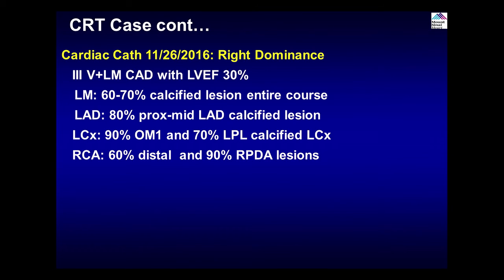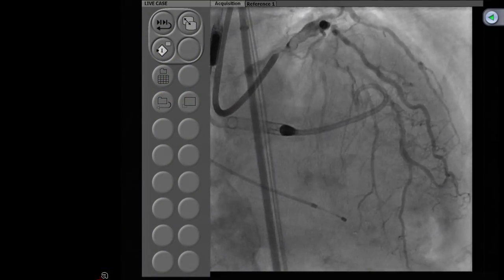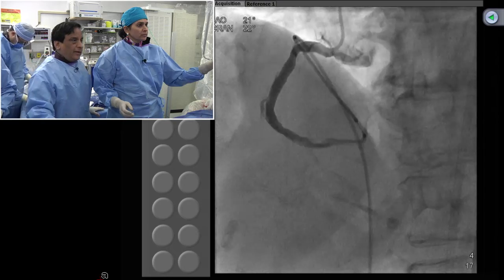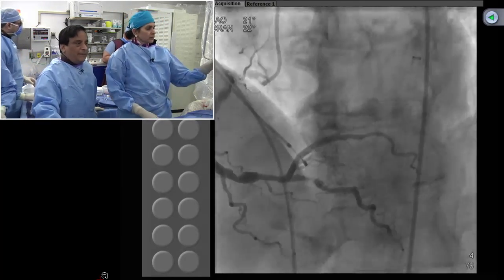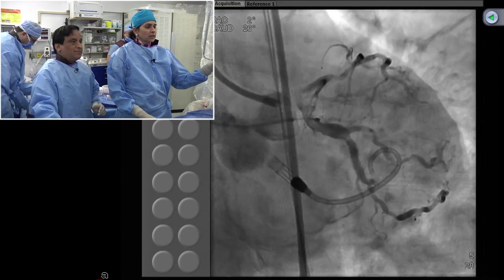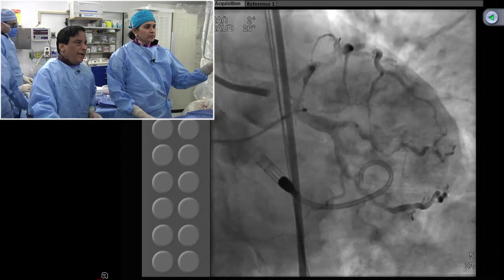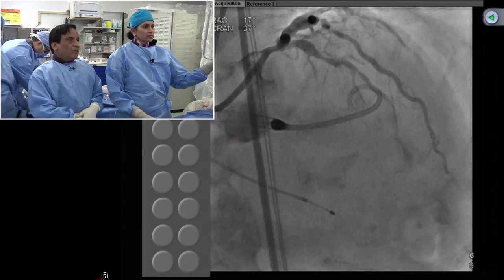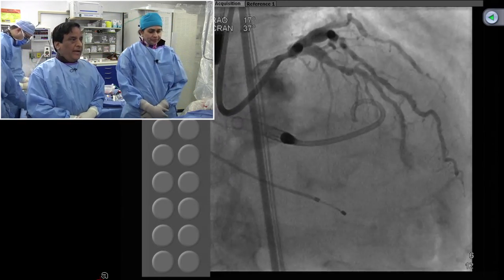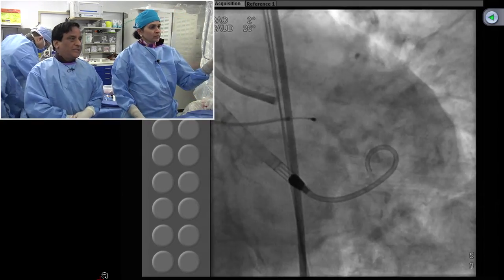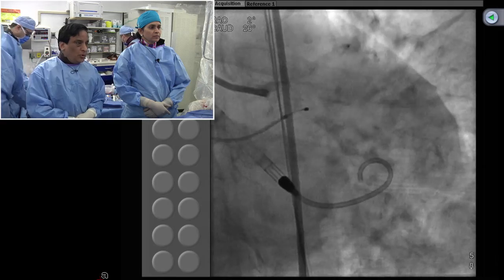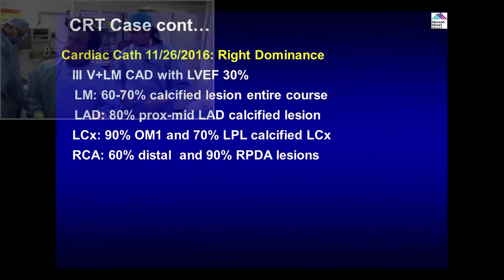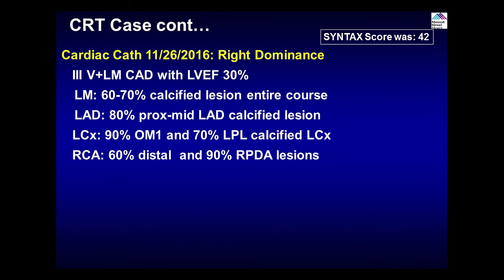The creatinine is about borderline 1.8 for her. This is tight disease of the distal RCA, more so of the PDA. But we are not showing this case for this part — look at the calcium of the distal left main and LAD. The disease is truly from the distal left main to the LAD, so it would be a 1-1-0 if we call the circumflex actually as a side branch, although the circumflex is equal size. And there is additional disease in the branches of the circumflex, both OM2 as well as LPM.